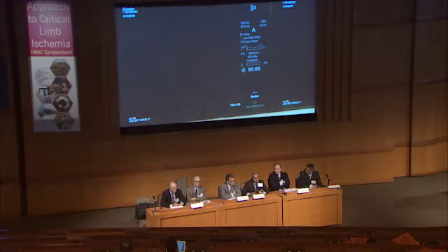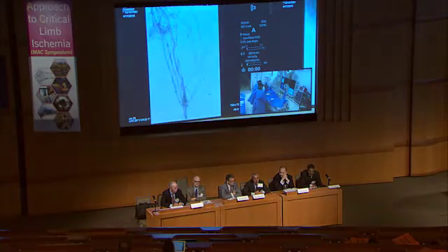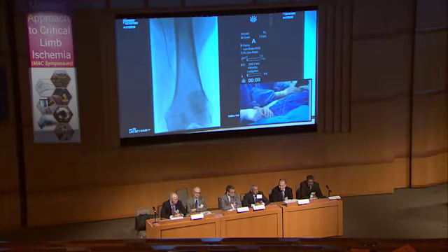But from the imaging, it doesn't seem to be a high flow. There is a venous return, but it's not so high. I think there is no steal syndrome below the knee so evident. So probably I would evaluate these fistulas after the first SFA recanalization up to the popliteal artery, and decide if there would be a steal syndrome for below the knee or not. This is, I think, important for the patient.